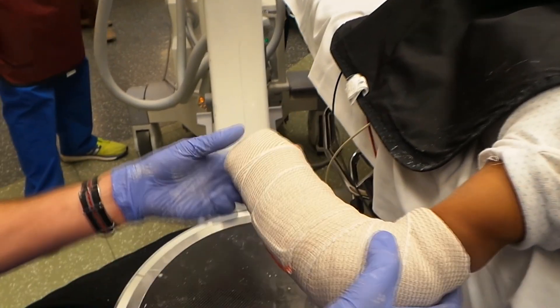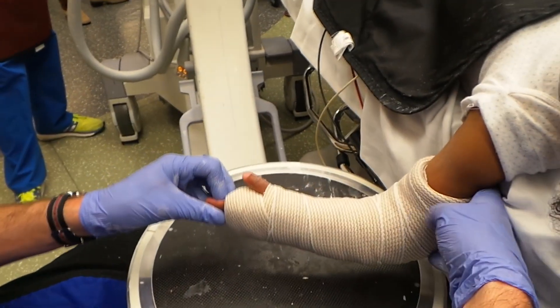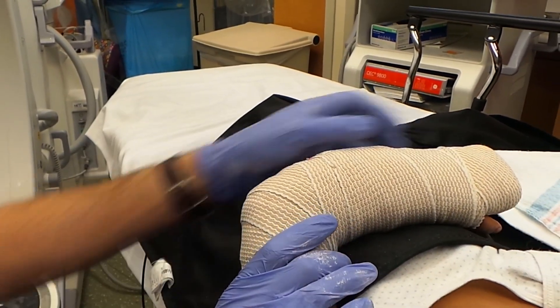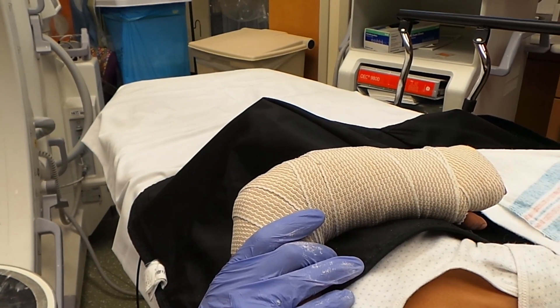All right, two more pictures — that should do it. That's all there is to it. Thanks so much. We'll take some post-reduction films, and if all looks good, she can head home after that.